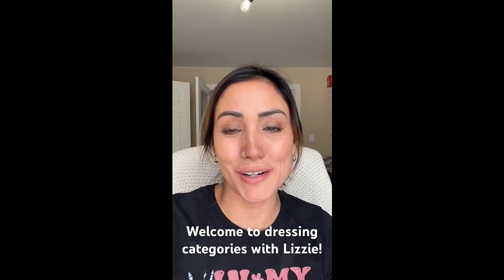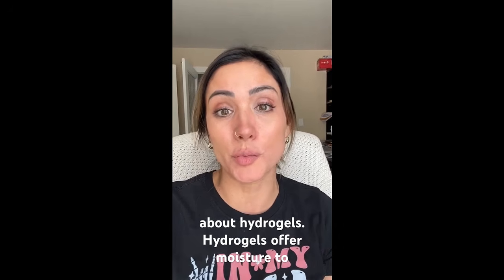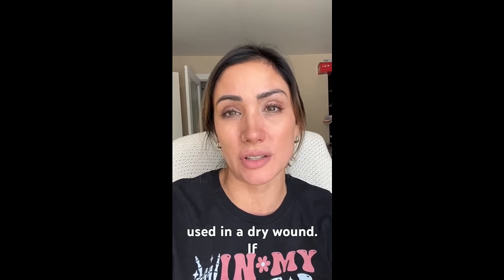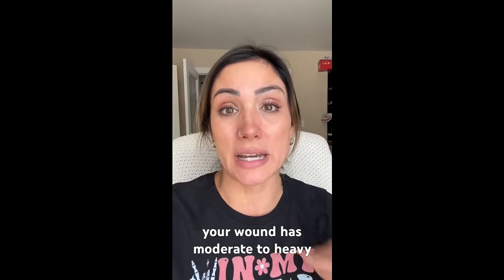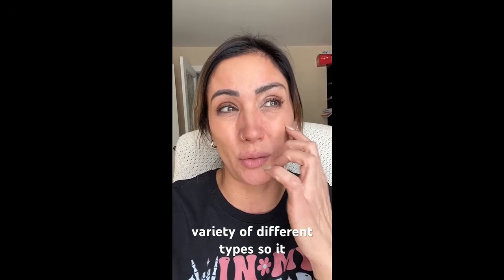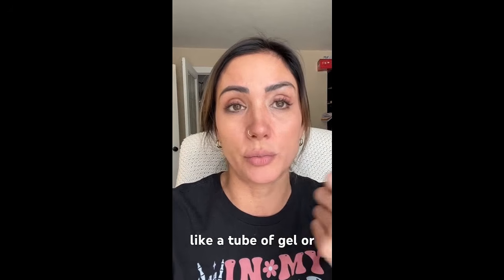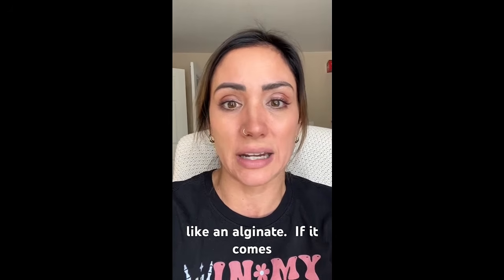Welcome to Dressing Categories with Lizzie. Today we're going to be talking about hydrogels. Hydrogels offer moisture to the wound bed, so it's often used in a dry wound. If your wound has moderate to heavy exudate, it is not appropriate for a hydrogel. Hydrogels can come in a variety of different types, so it could be a literal gel, like in a tube, or it could be in a spray, it could be in a sheet, or it could be blended with another ingredient like an alginate.